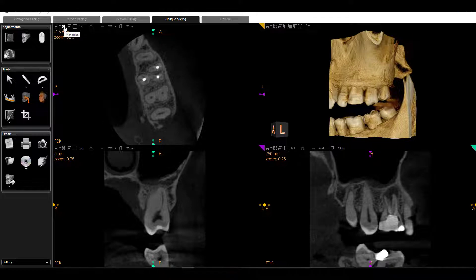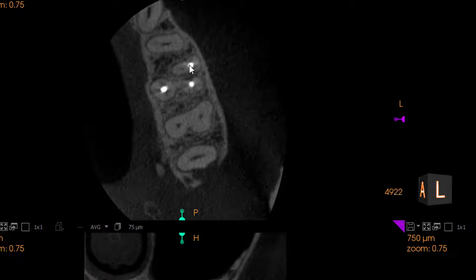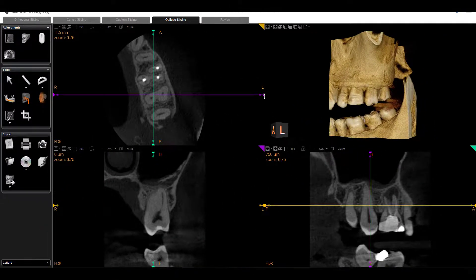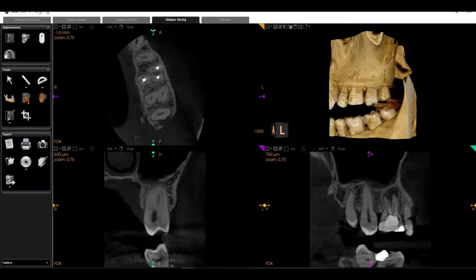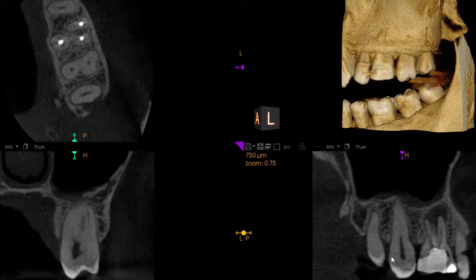Now let's look at our missed MB2 a little bit more closely. We can see our MB, our treated canal, and we can see how this is off-center. We can see our figure-eight shaped root, and we can see our missed MB2. I can line up my crosshairs onto that area of interest, or an easier way is to point to wherever I want and press down on my mouse wheel — my scroll wheel — and it's going to center all my views on that area of interest.